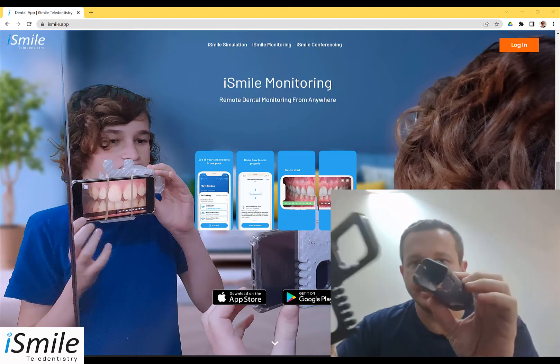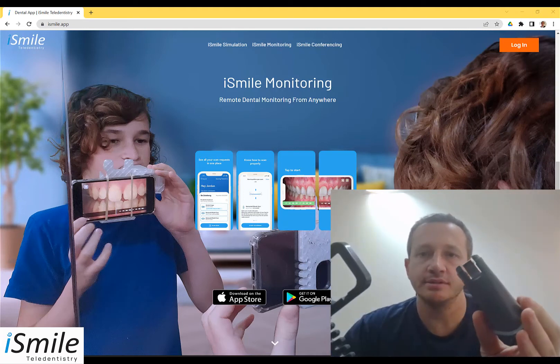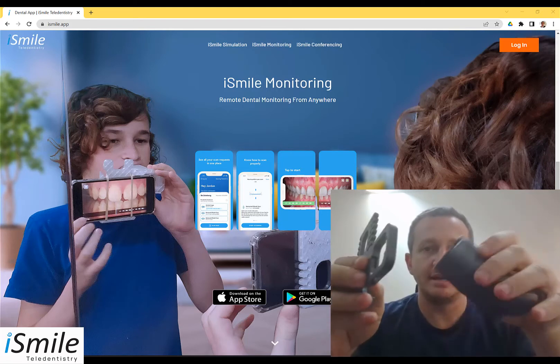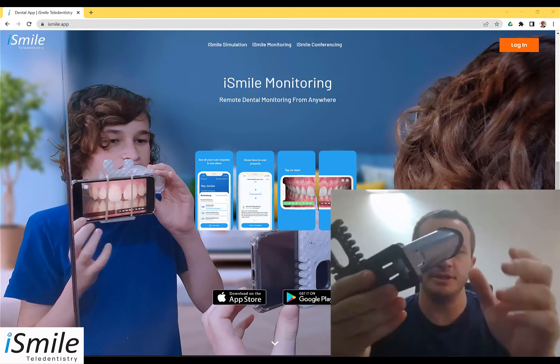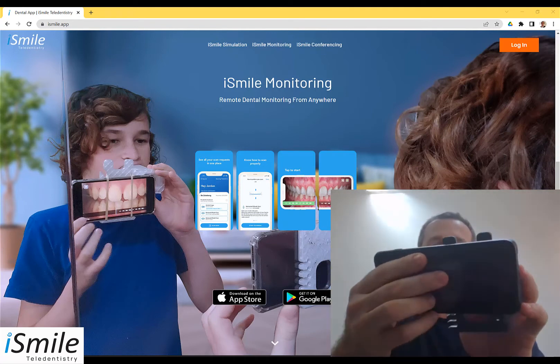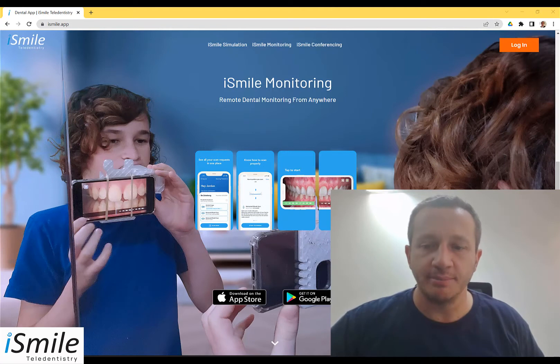So you've recently been to the dentist and the dentist probably gave you a scope that looks something like this — maybe you got the separate pieces, maybe it came in a box. Using it is simple: simply assemble the pieces and click them together, attaching your cell phone with its camera, and performing the scan. Let's take a look at the process flow on exactly how to do this step-by-step.